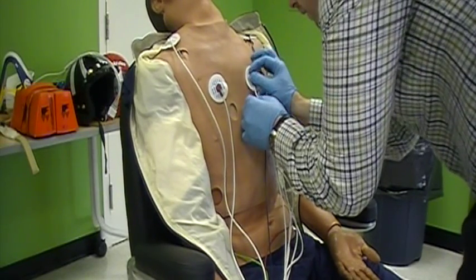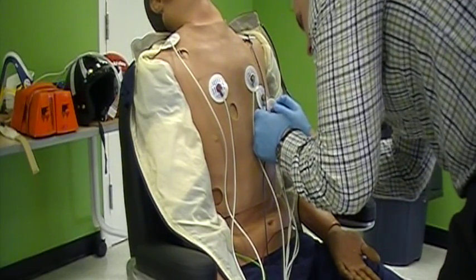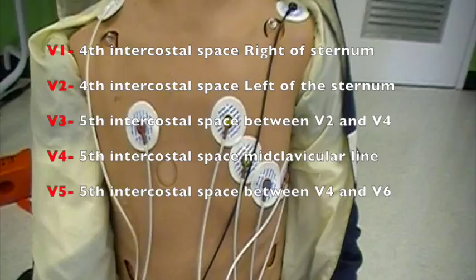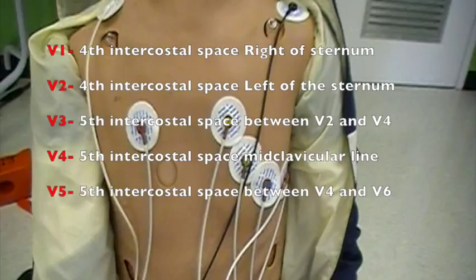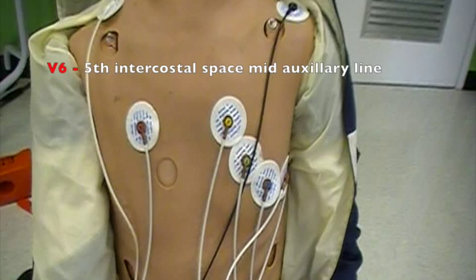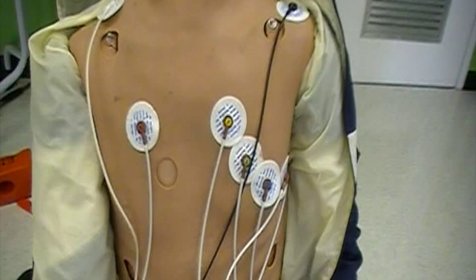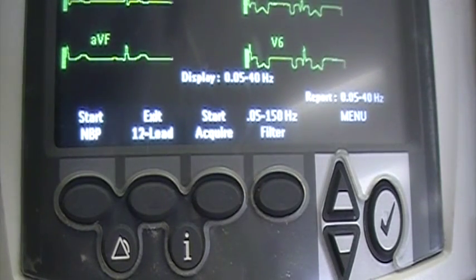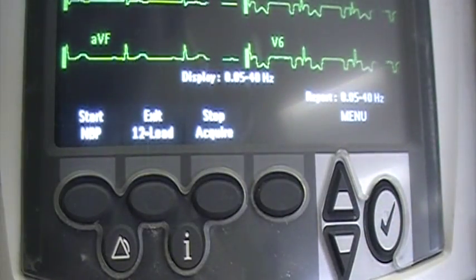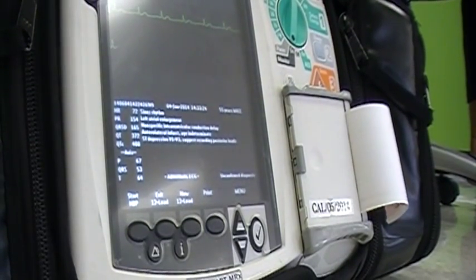Explain the procedure to the patient and identify and prepare all required equipment. Prepare the chest and landmark appropriately. Place V1 at the 4th intercostal space right of the sternum. V2 in the 4th intercostal space left of the sternum. V3 goes in the 5th intercostal space between V2 and V4. V4 goes in the 5th intercostal space at the midclavicular line. V5 goes in the 5th intercostal space between V4 and V6. V6 goes in the 5th intercostal space at the mid-axillary line. Click the 12-lead button, ensure the patient remains still, acquire the 12-lead, and select the appropriate settings. A strip will print automatically. Analyze the 12-lead and transmit it as appropriate.